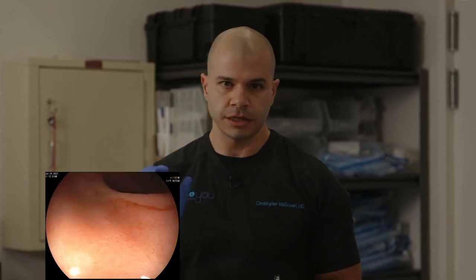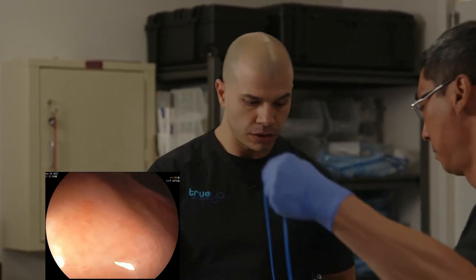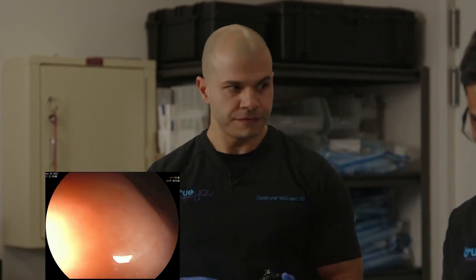And now what we're going to do is move on to the process known as argon plasma coagulation. We're going to treat the anastomosis using heat to start the process of tightening this. That also has several other effects. But we're using an ERBE electrosurgical device.